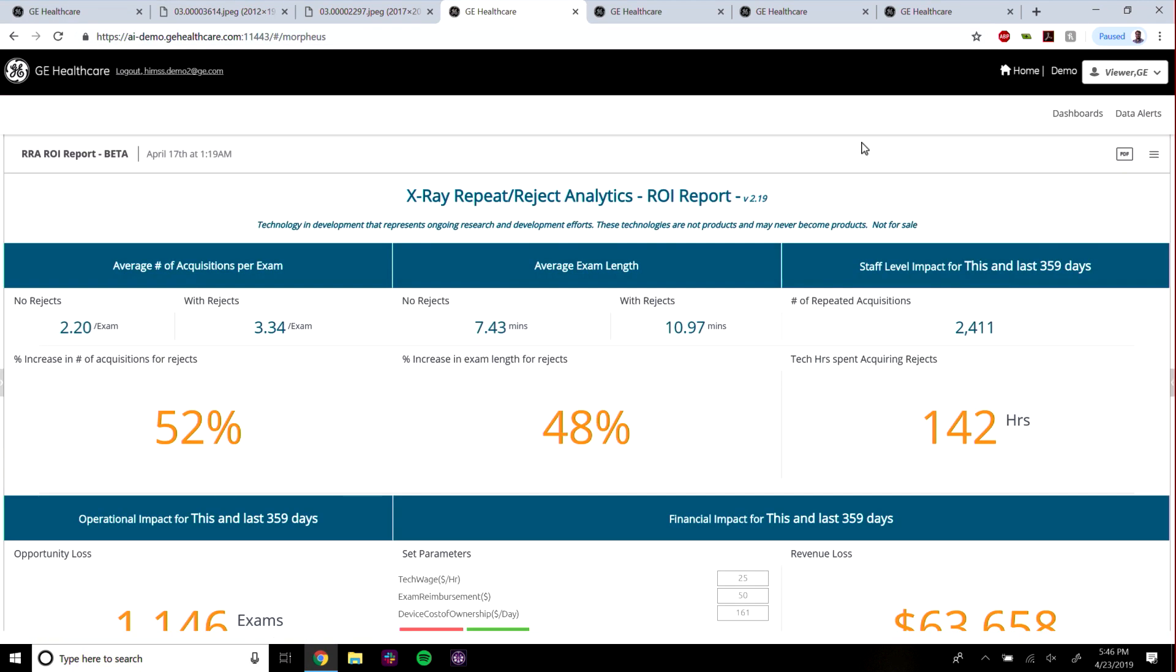In release two, we've added a dashboard that quantifies the impact of rejects within the department.